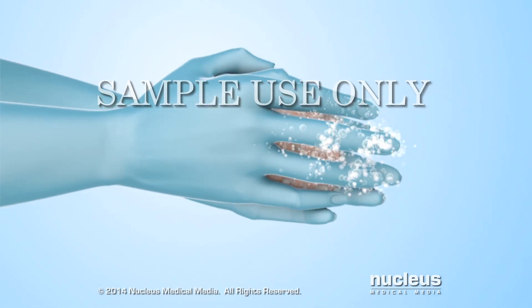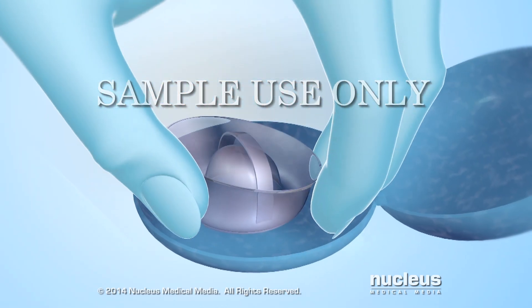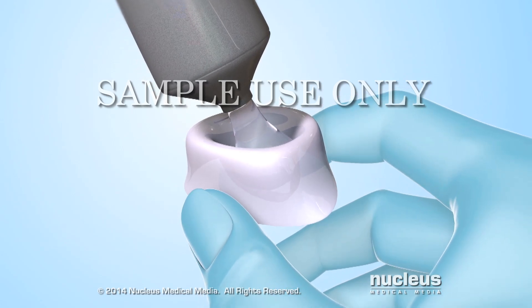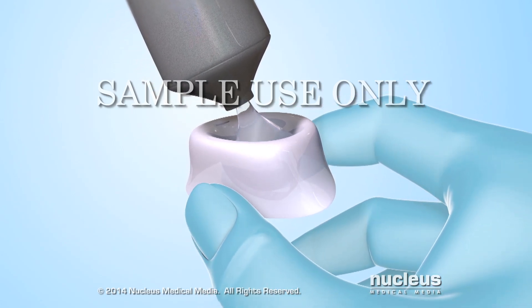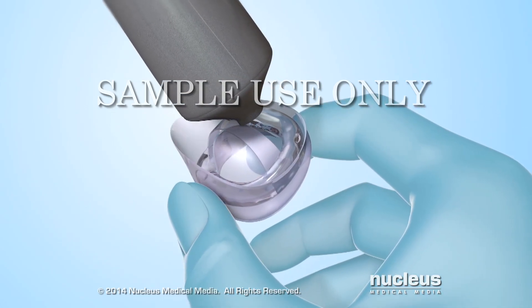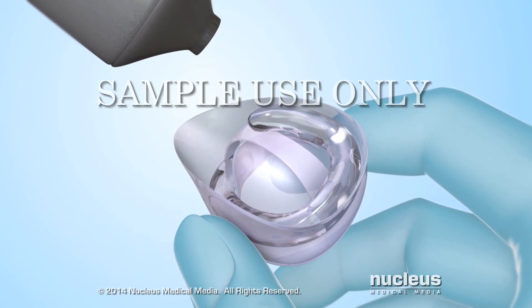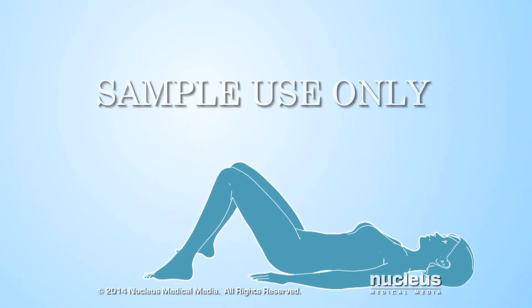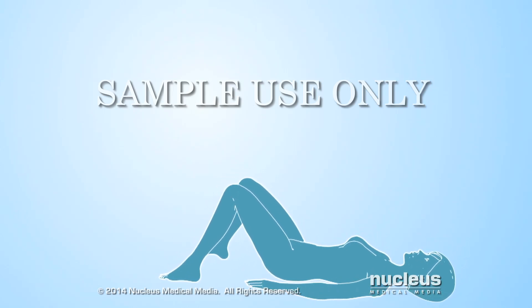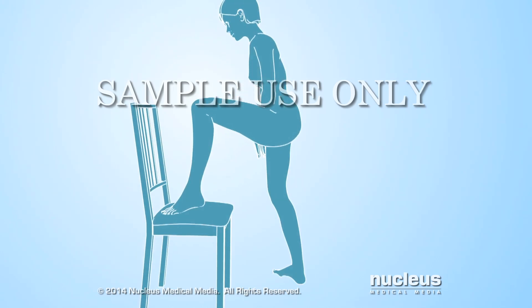To use a cervical cap, wash your hands and remove it from its container. Apply one-quarter teaspoon of spermicide inside the dome, up to and including the brim. Apply an additional one-half teaspoon of spermicide in the groove between the outside of the dome and the brim. Next, choose a position for insertion: you can lie down with your knees bent, squat with both feet on the floor, or stand with one foot on a chair.